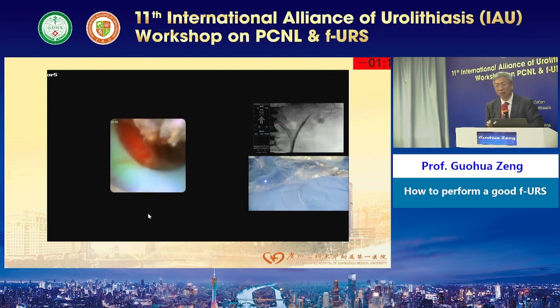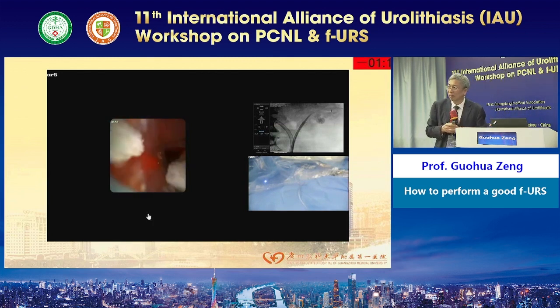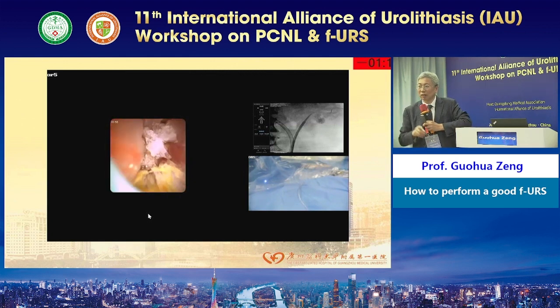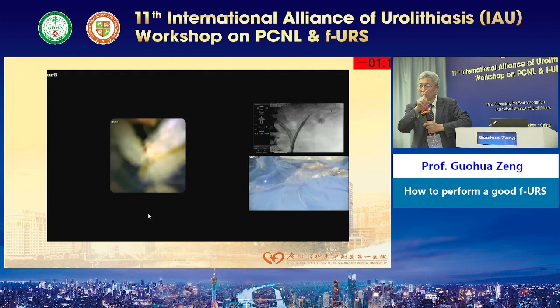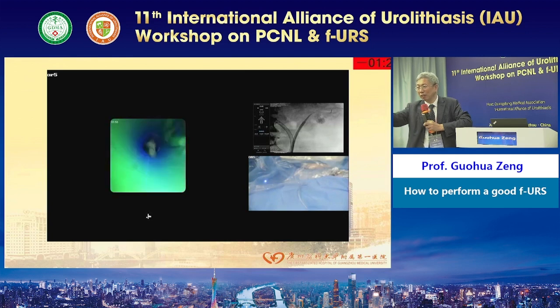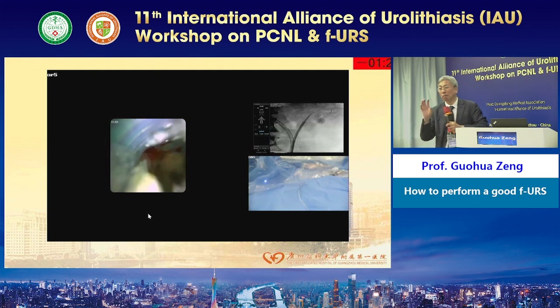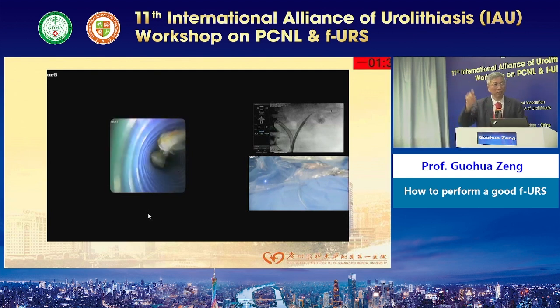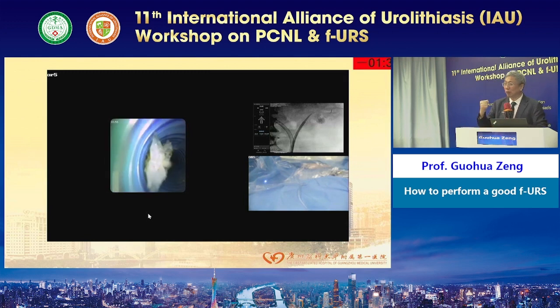Is this a sheath with a steerable tip, or the sheath you left in the upper ureter or in the kidney, in the collecting system? Steerable tip. It's bendable, but the bending uses this scope. Yeah, the scope bends. It's passive, not active.